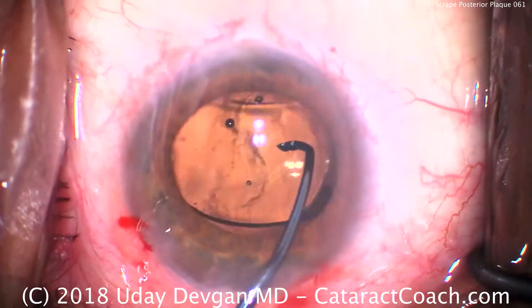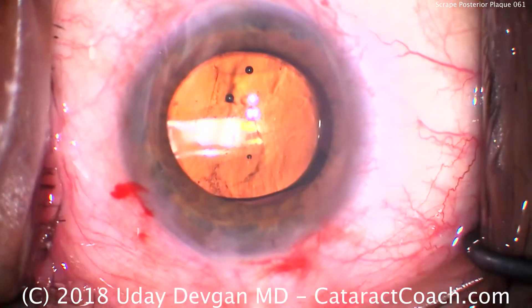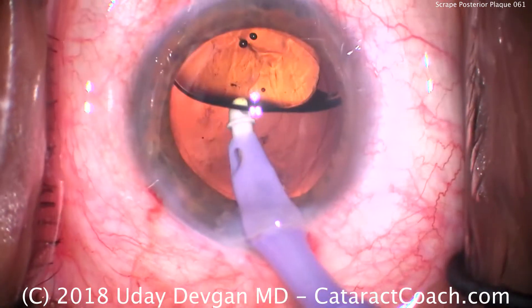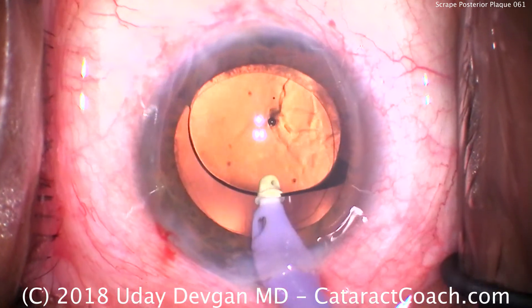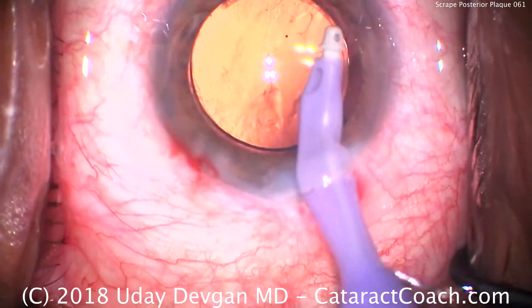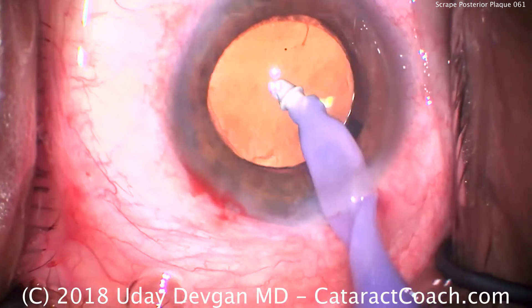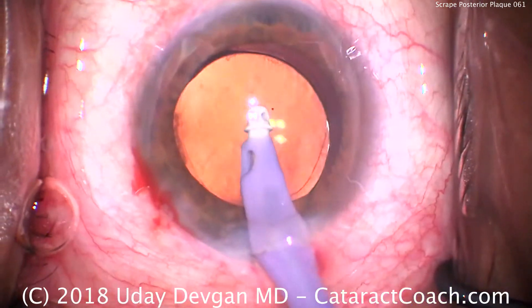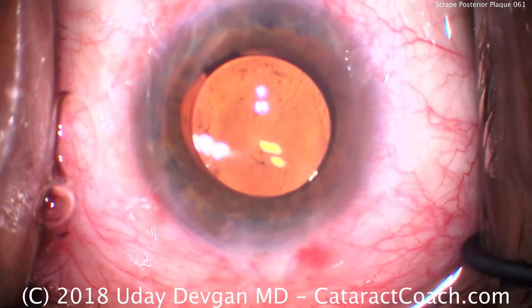The IOL is being placed in the capsule bag and rotated to the appropriate position. This patient is hyperopic — it's a small eye, small white-to-white, and that's why the six millimeter optic looks so positively huge. Removing the viscoelastic from behind the IOL and from the anterior chamber. The lens is beautifully centered, and the capsulorhexis overlaps the optic for a full 360 degrees.